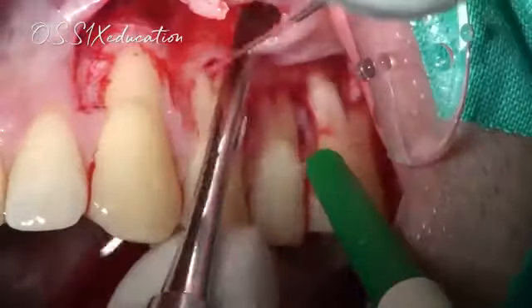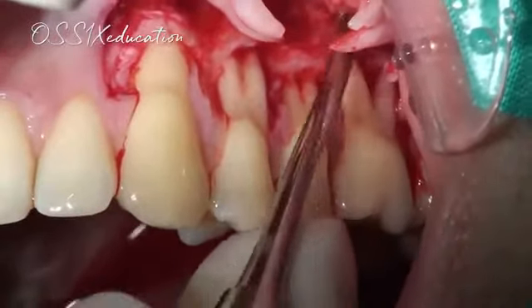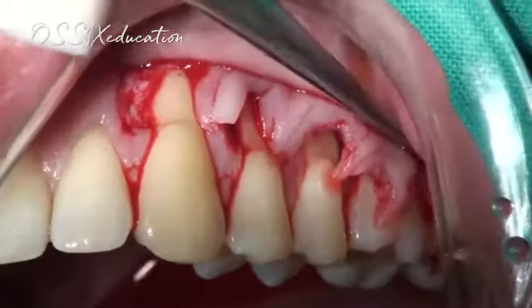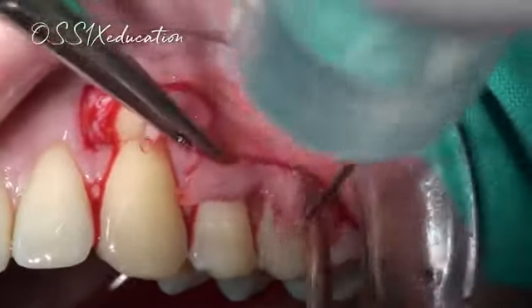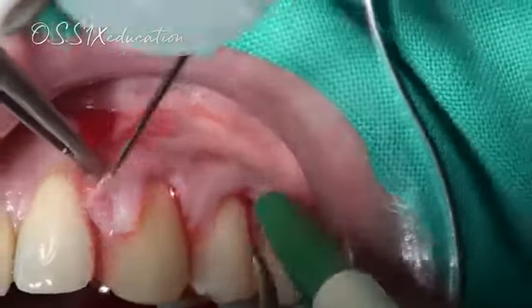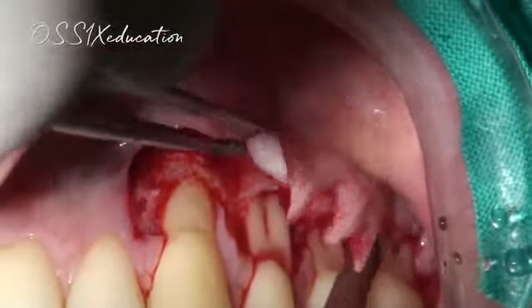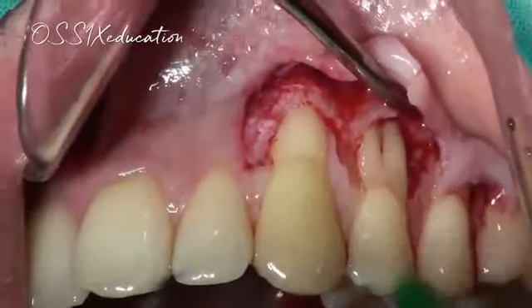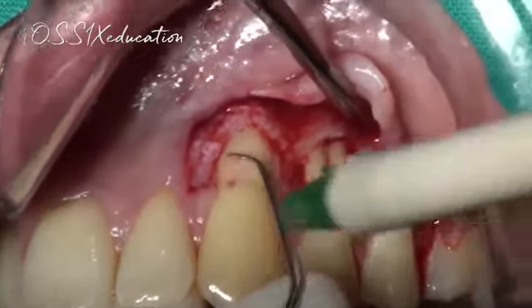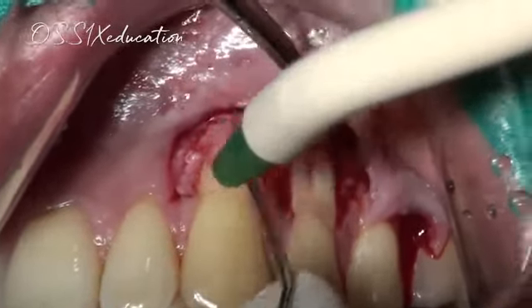The intention is that you want your flap to be as passive as possible, so you want your flap to basically go by itself down in a coronal position. You can see here that we can pull it easily a few millimeters above the cemento-enamel junction. If you feel that there's a little bit more tension on the flap, continue separating the muscle fibers and continue detaching the flap until it lies completely passively over the roots and over the crowns of the teeth.